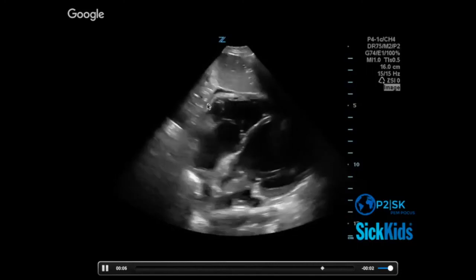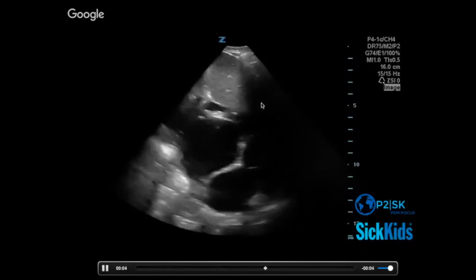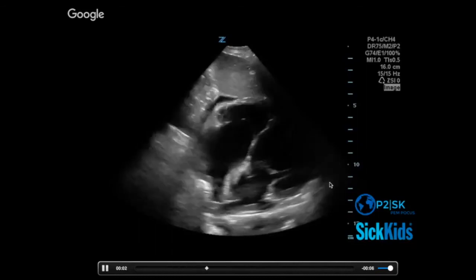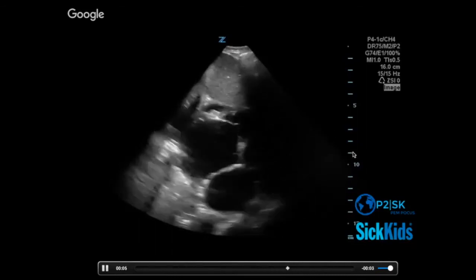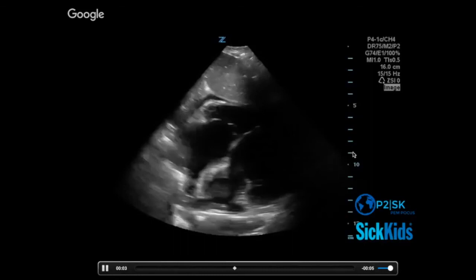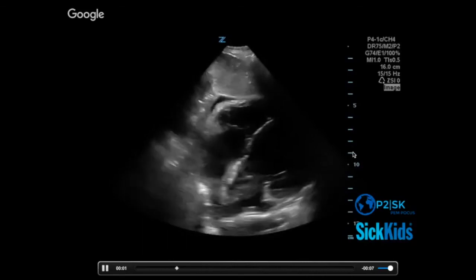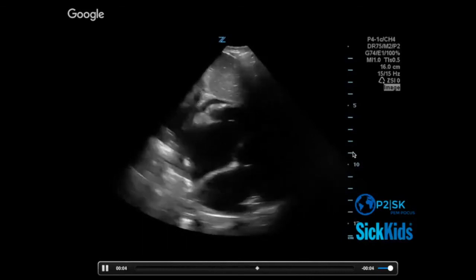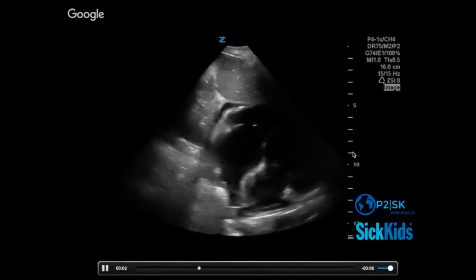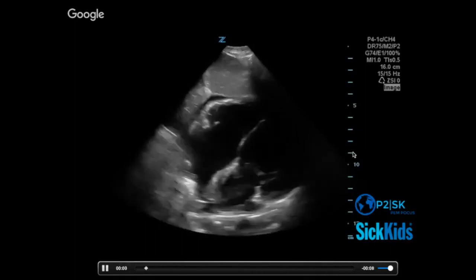This is the border of the right side of the heart. And to call it effusion, it gets simple. You can feel really confident about calling it effusion when you see it skirt to the left side. When it makes that corner around the apex, that's when most of us would say, I think this is an effusion and not just physiologic fluid. The squeezing of the function. Yeah. So you'll hear me preach, the best view for function is the parasternal long, but that doesn't mean you can't use other views. So everyone was able on this subxiphoid view to identify the fact that they have suspicions about poor function.